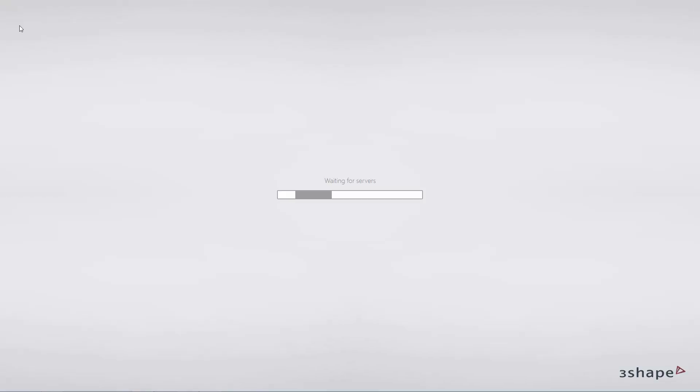To start working with Implant Studio 2015, click the Implant Studio icon on your desktop. To log in, click your personalized operator or default operator.